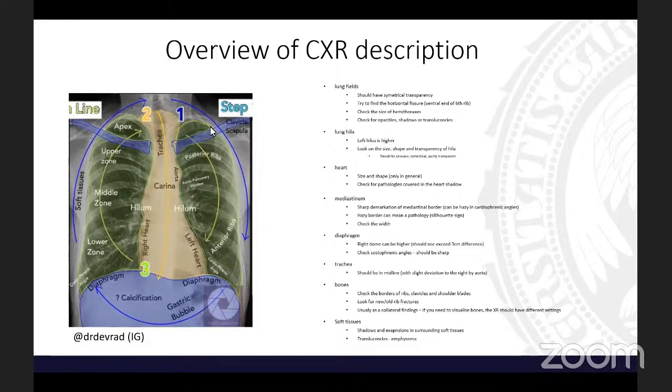So lung fields, that's like this. We are not talking about lungs on chest X-ray. We are using lung fields and lung zones because they contain not just lungs, but also all the soft tissues in front of the lungs, on the back and anteriorly, and all the muscles also, pleura, ribs, everything. So if you have some shadows in here, it can be anywhere. It's not necessarily in the lungs. That's why we are not using lungs. We are using lung fields and lung zones. I hope that's clear.